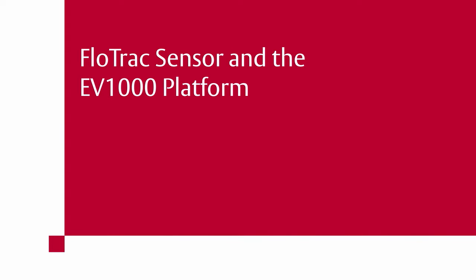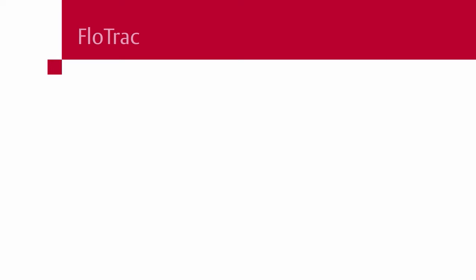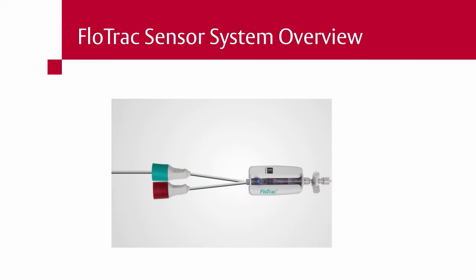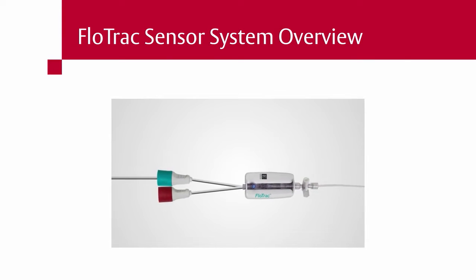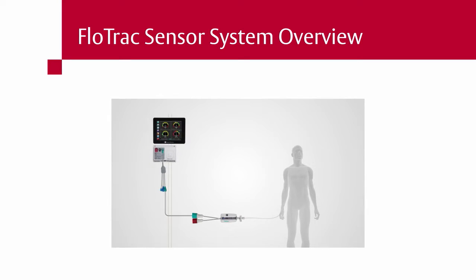This video covers the FlowTrack sensor and the EV-1000 platform. Proper setup of the FlowTrack sensor for use with the EV-1000 clinical platform requires the following components.